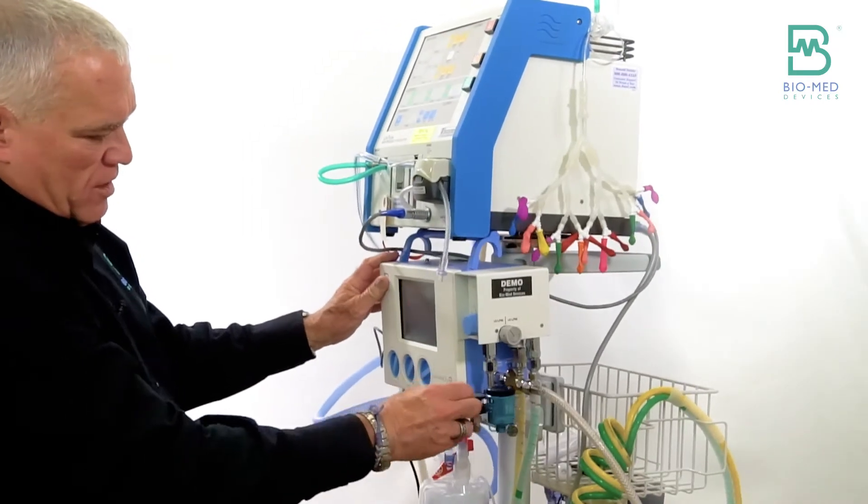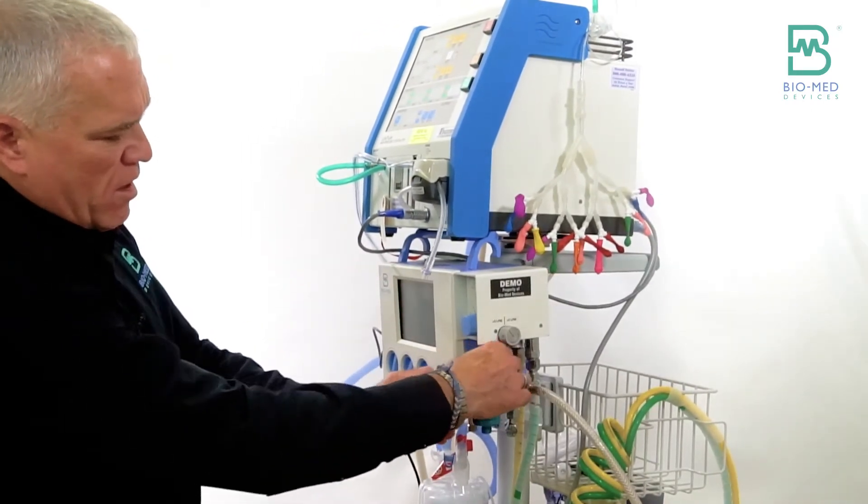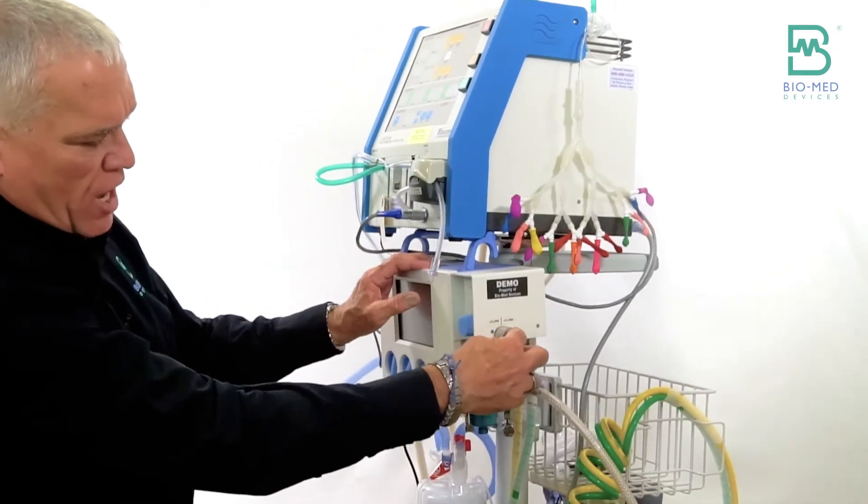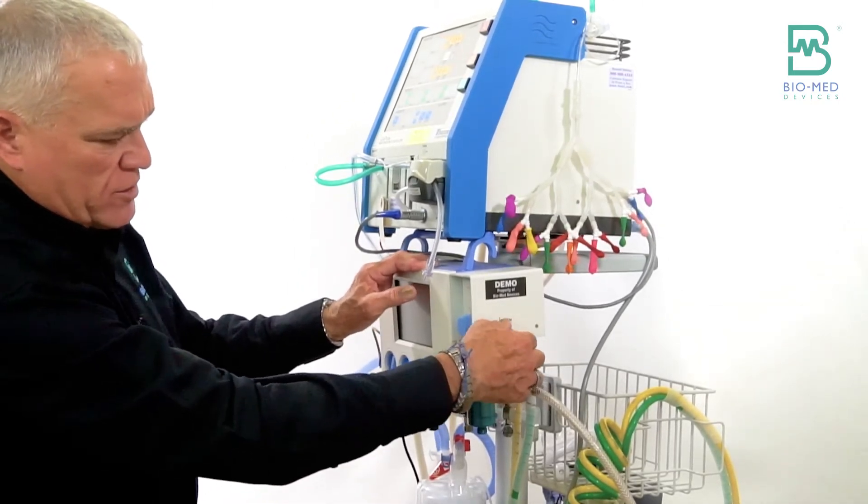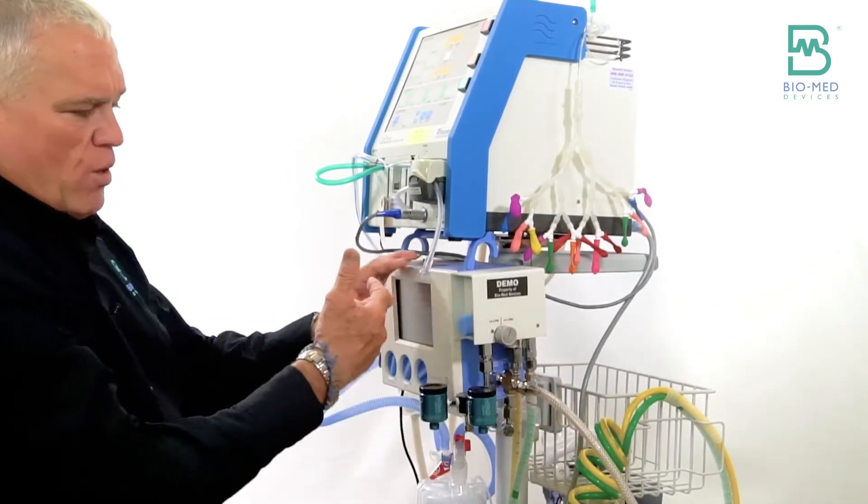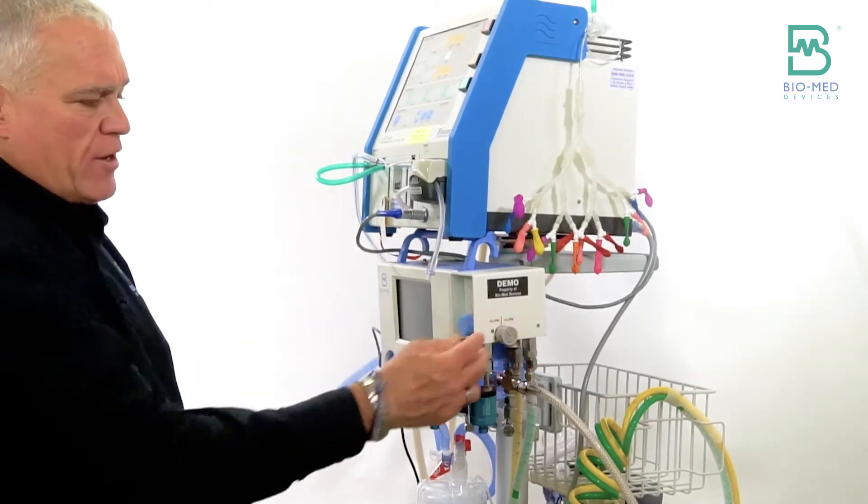As far as the blender goes, the blender has a knob on the side and it says greater than three liters, less than three liters. What that's about is just accuracy.